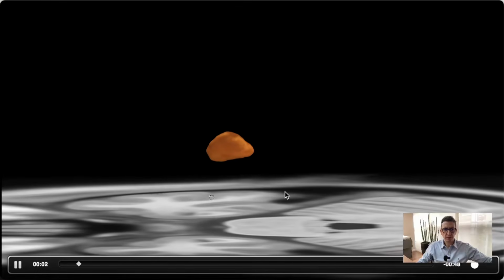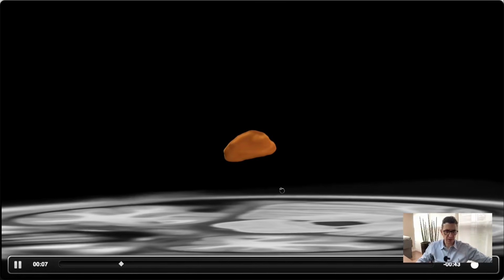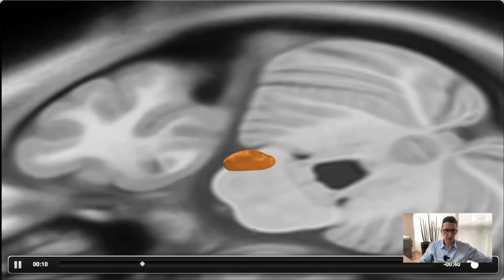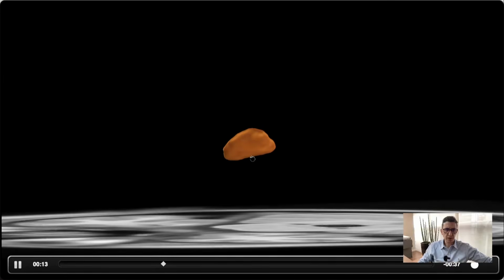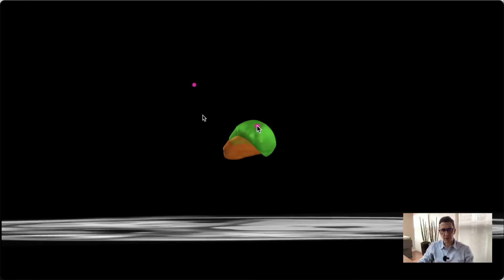And this is really important because I'm going to slice the STN like this. In the next class, you're going to see that. Here you have a 3D view of the STN, and then I'm going to insert here this cluster of stimulations where you're going to see a good response. The first thing that you're going to see is that outside the STN, maybe in the dorsal part, you can see some benefit. And you know this, if you program patients in a routine, you're going to see that some patients, when you stimulate in the dorsal part of the STN, you can see some benefit.